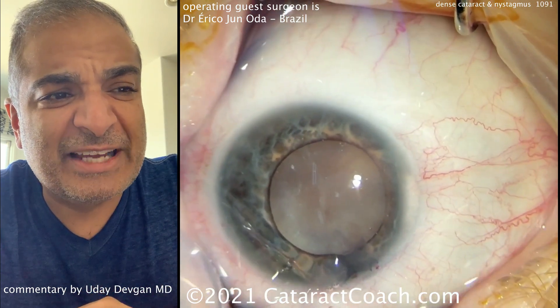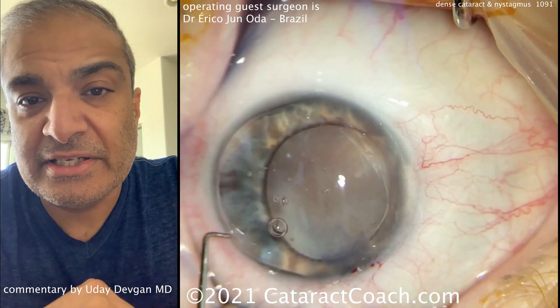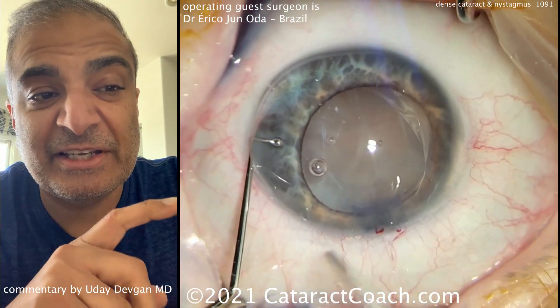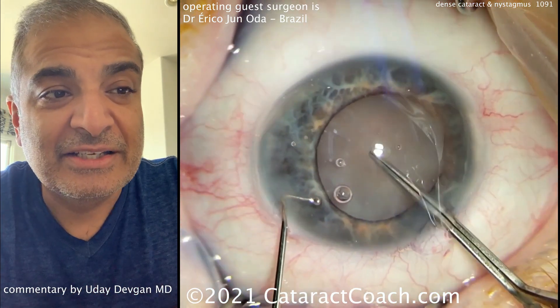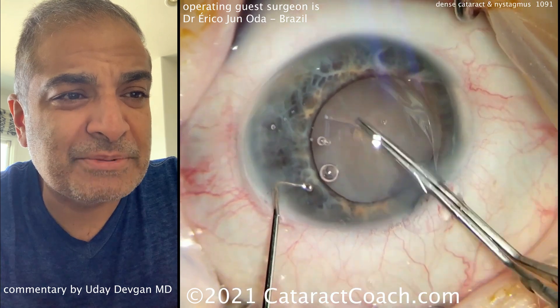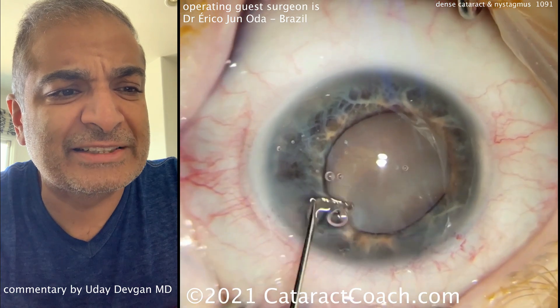You can see the dilation — not the best dilation. In a dense cataract like this, it's very important to make a sufficiently large capsulorhexis. Do not make a baby rhexis. Stabbing in here with the forceps, getting that flap turned over, looking good. Nice, generous capsulorhexis.